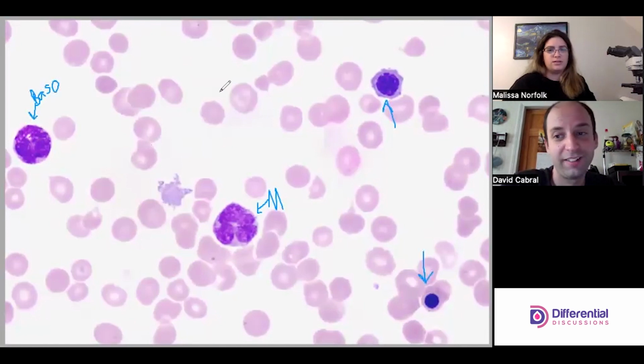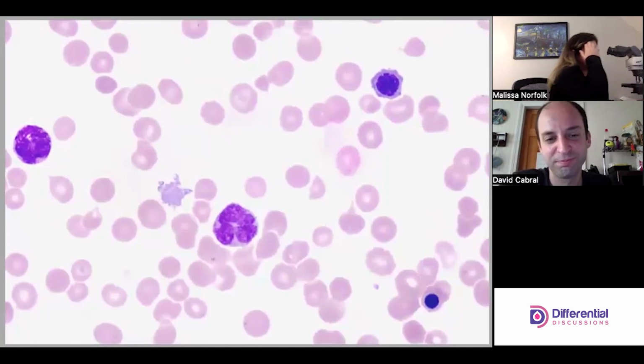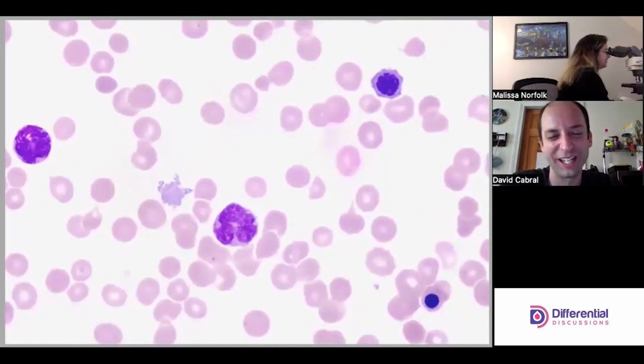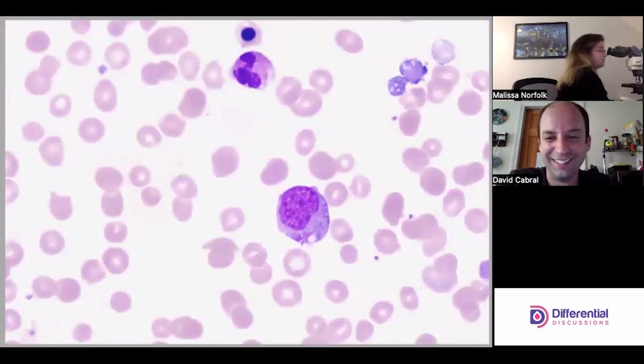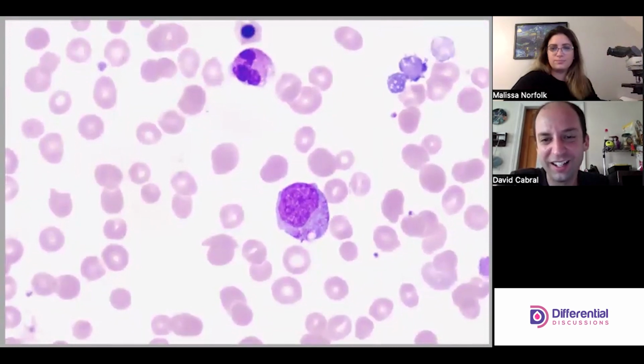There's 4 targets here. I got 2 targets. I'm gonna eat my words, maybe. We'll see. I don't remember what the red cell morph is for the key on this one. That's because it's not the most exciting thing. Maybe it's because I want to forget. Yeah, want to forget this one.